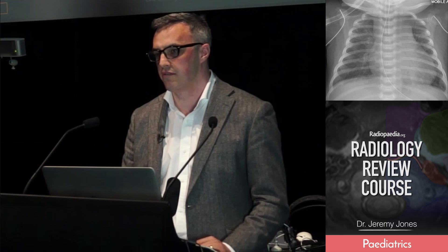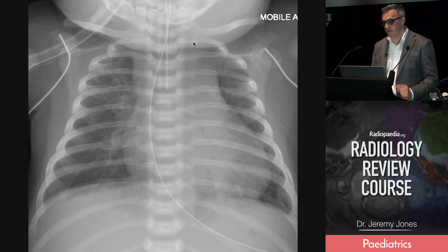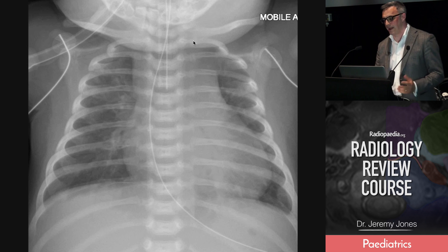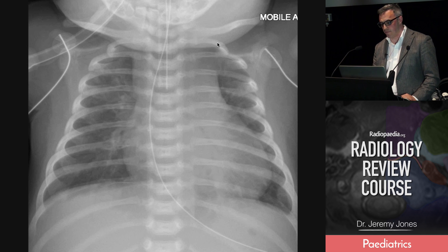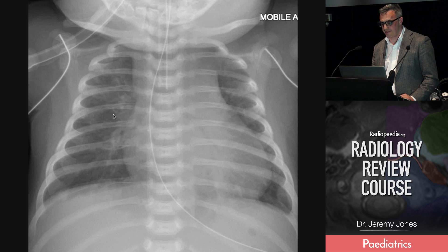In any child under one, you've got to be looking for rib fractures. I start at the top — for whatever reason I start on the left — and I always look at the posterior portions of the rib from medial to lateral, each one going down all the way to the bottom. Then I start at the turn of the lateral portion and move to the costochondral junction, doing that individually, then go to the other side and do the same.